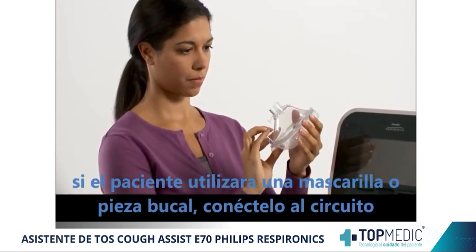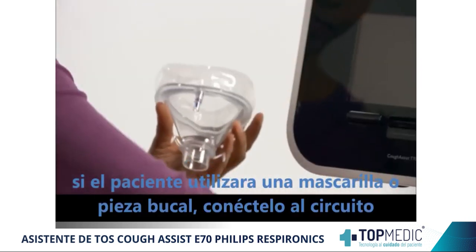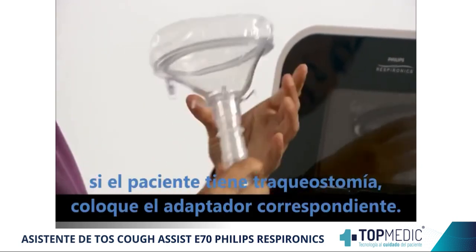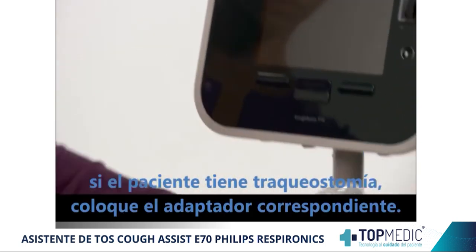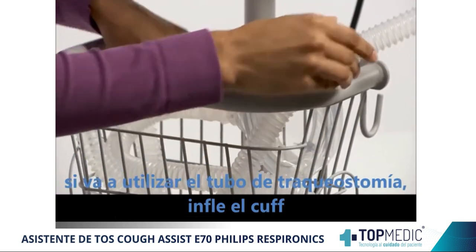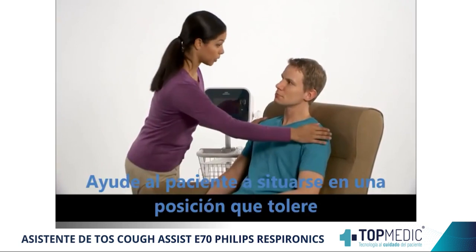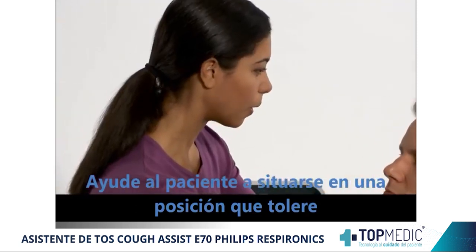If the patient will be using a face mask or mouthpiece, attach it to the circuit tubing. If the patient has a tracheostomy tube, place a trach adapter on the circuit tubing. If the trach has a cuffed tube, inflate the cuff. Help the patient into as upright a position as he can tolerate.